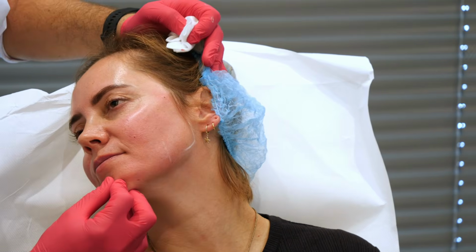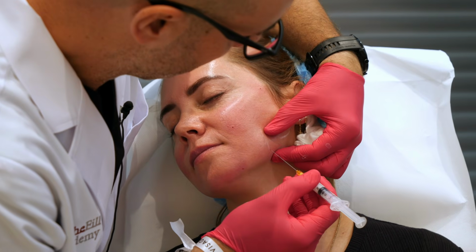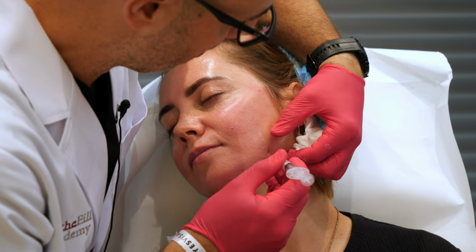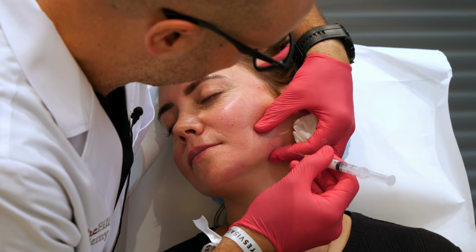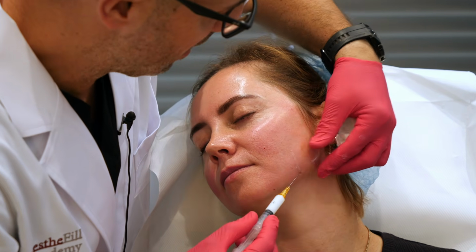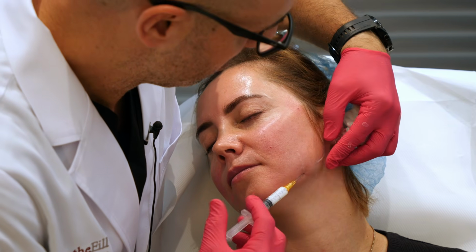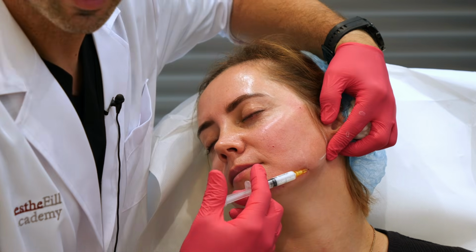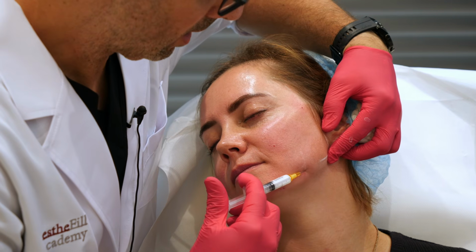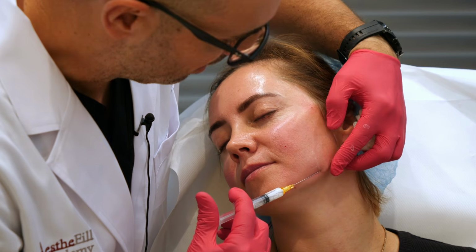Because I'm right-handed, I will go from here to the jaw angle. Okay. And first define the jaw line.